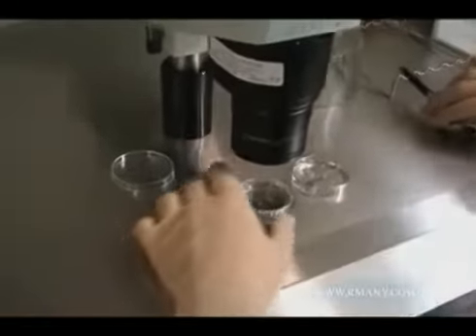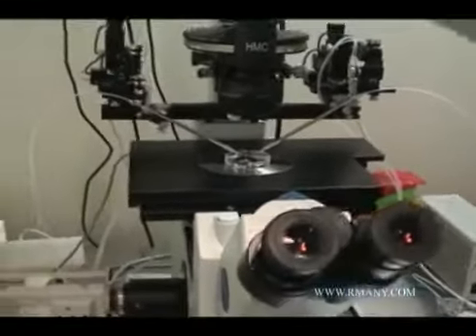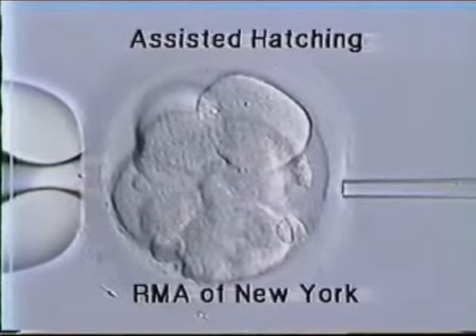The dish is then moved to the micromanipulation station, where a highly skilled embryologist will hold the embryo with a holding pipette on the left and perform the hatching with a pipette on the right. The hatched embryos are then moved to a dish in final preparation for the embryo transfer.